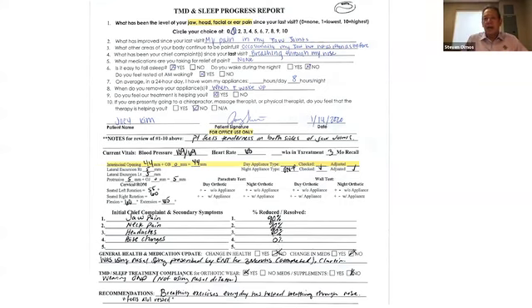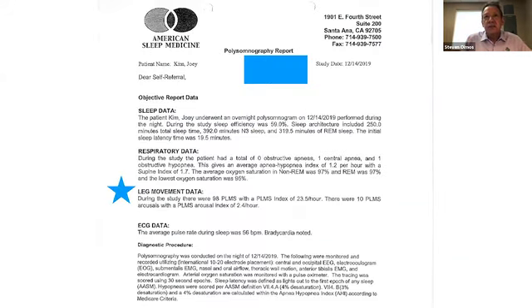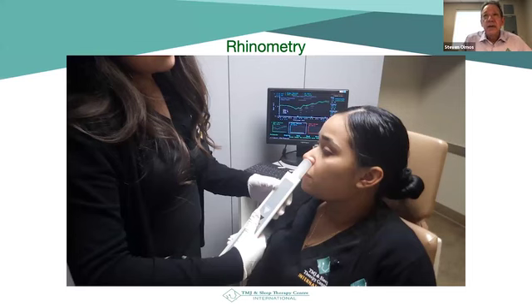But at this point, I had asked for a sleep study. And it turns out that, here's the sleep study. It turns out she doesn't have a respiratory problem with sleep, but she has a very big problem with periodic limb movement, 23.5. Anything over 15 is usually treated with medications. But sometimes in women and men too, there can be low iron levels. And so the solution can be as simple as iron supplementation. So, that's what they're looking at to treat her with.